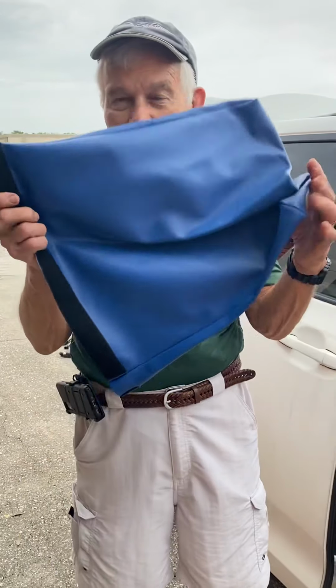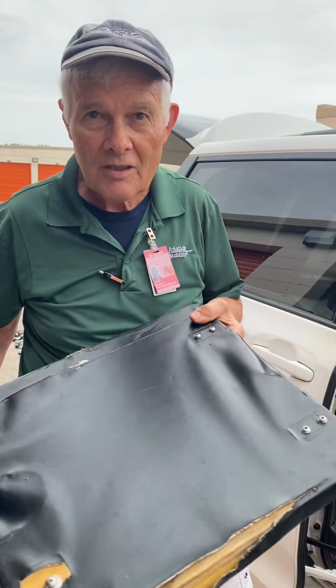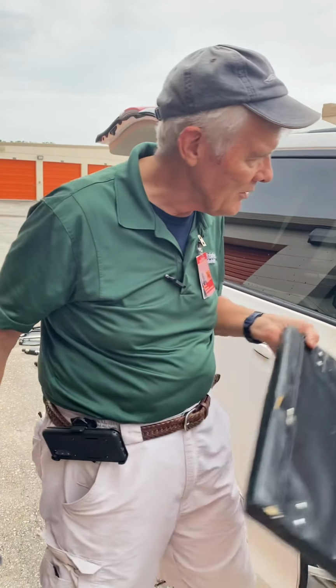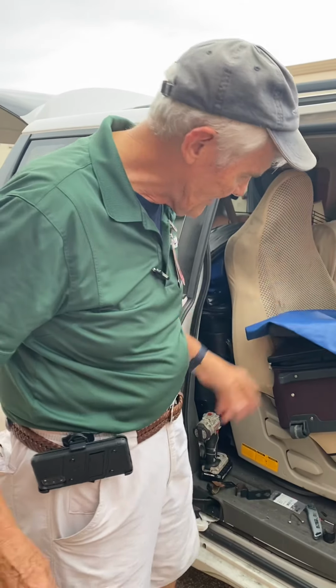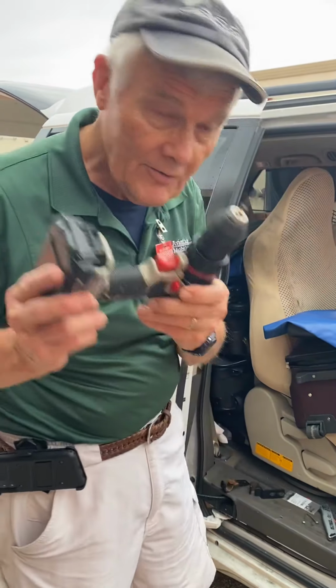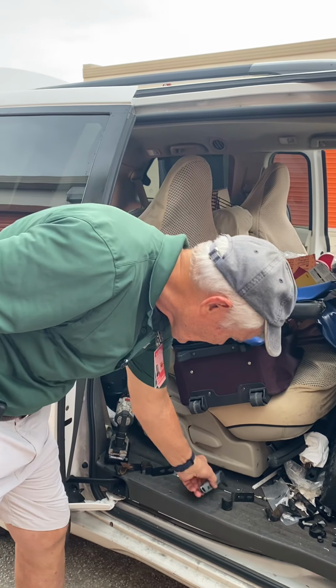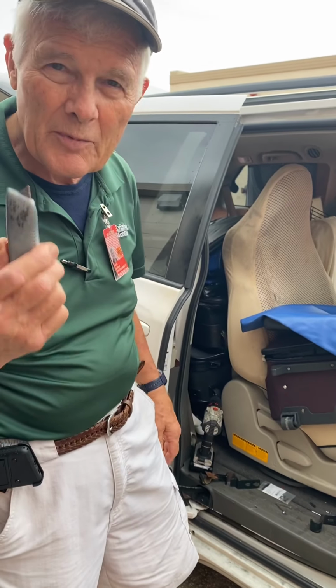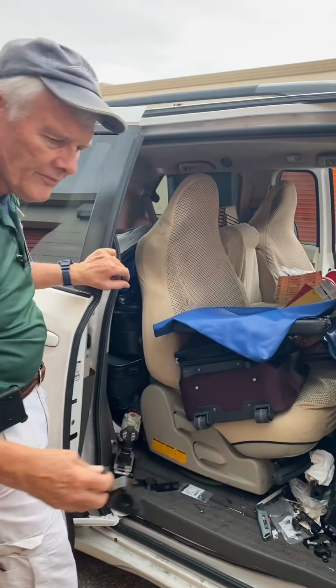Video of how to put a blue seat cover on a 20-inch seat for a 20-inch traditional wheelchair. The tools that you're going to need, of course, the seat cover, the seat, your electric screwdriver drill, and an all-purpose box cutter.